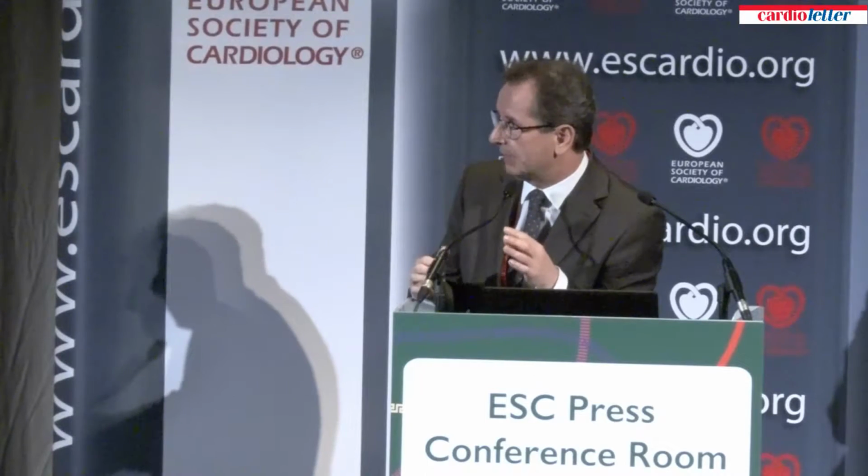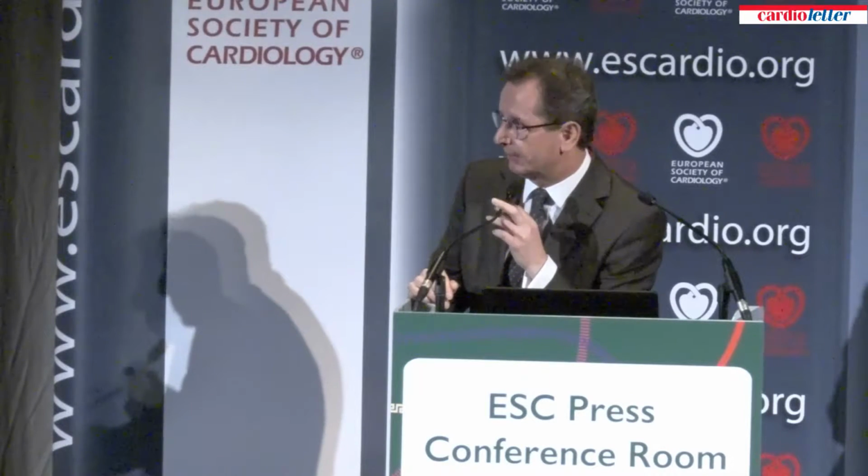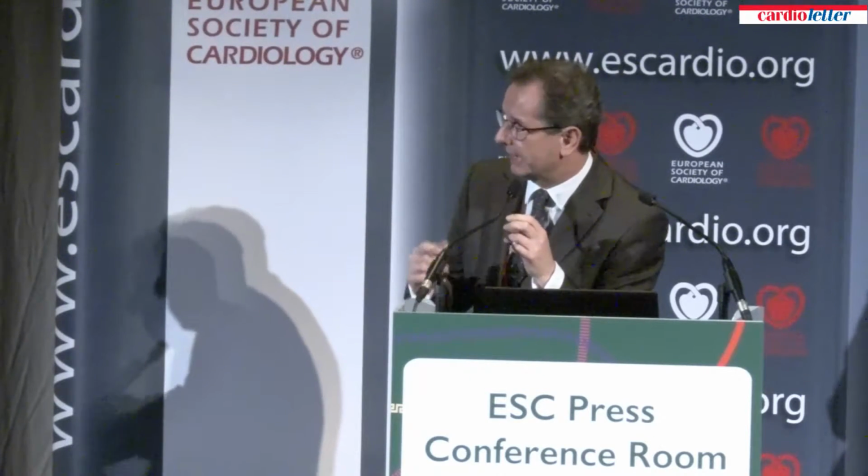Yeah, exactly. Andreas, your remark is perfect. This is an important point: you have to do final kissing balloon dilatation. This is an obligatory part of this procedure. I even had one experience of a patient without final kissing, and even the next day there was a problem with stent thrombosis. So we always try to perform final kissing balloon dilatation. That's why this approach is a bit technically more challenging, but if people are performing this procedure in daily routine, they will become skilled.